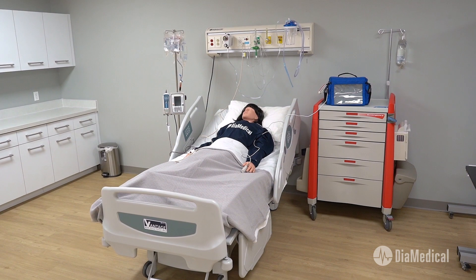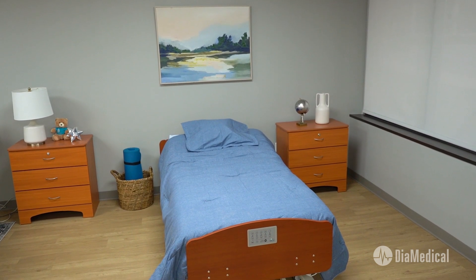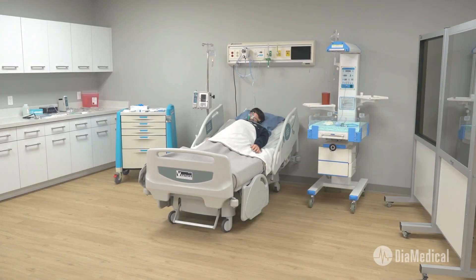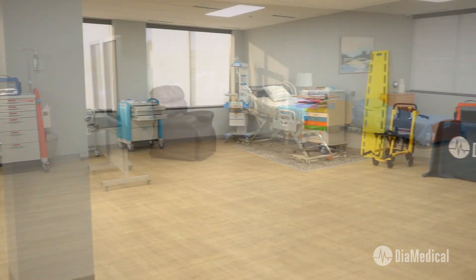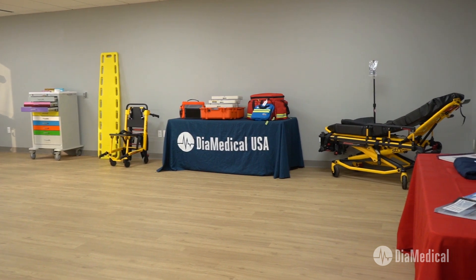By creating an immersive simulation lab program, educators have the ability to completely recreate care environments like the ones that students will work in after graduation. There are a multitude of ways to go about this depending on the educational focus. With the right environment and equipment, your space can be transformed into a dynamic learning environment that will promote clinical competence for safe patient care. Our team at DIA Medical is here to help. For more information on any of the products covered today or to request a quote, you can visit our website or give us a call.